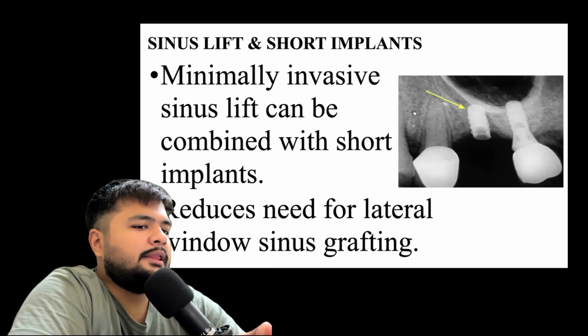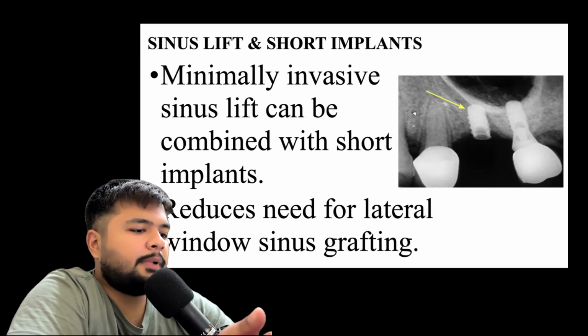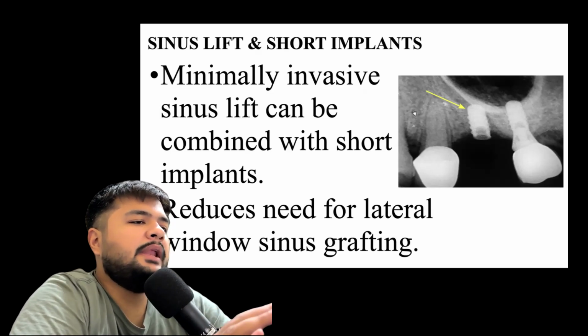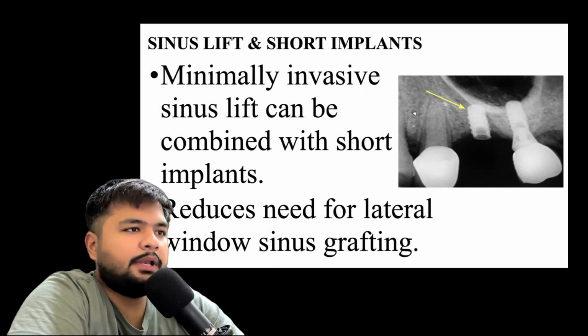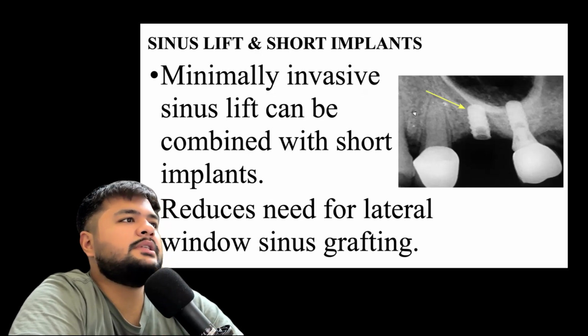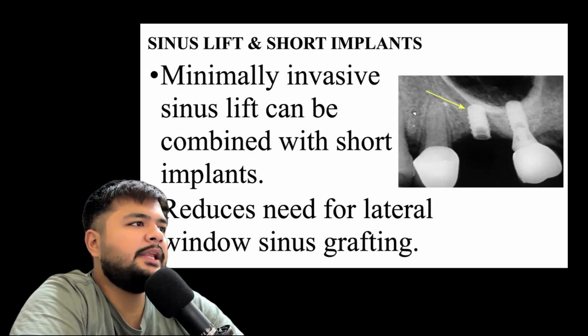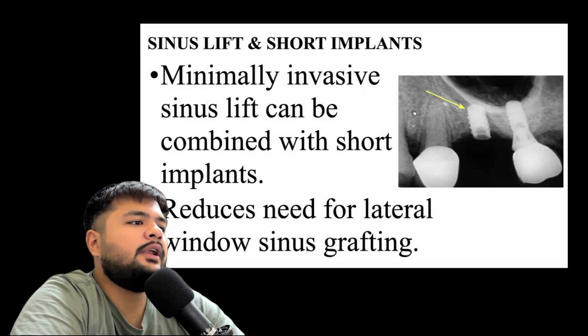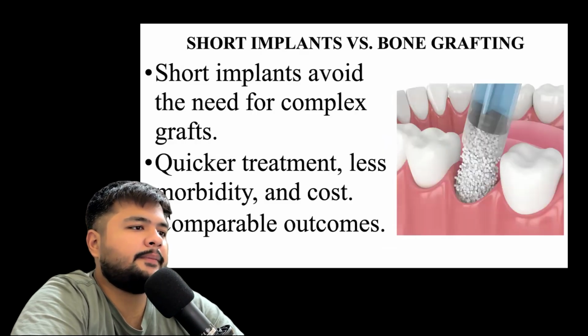So in the case of short implants, we are focusing on how to minimally restore the function and aesthetics of patients who have missing teeth. So the sinus lift and short implants: a minimally invasive sinus lift can be combined with short implants. It reduces the need for lateral window sinus grafting.